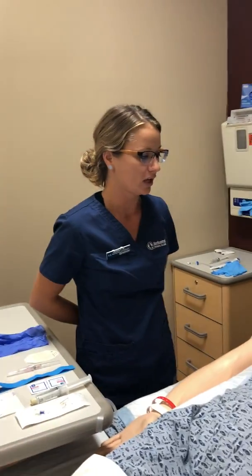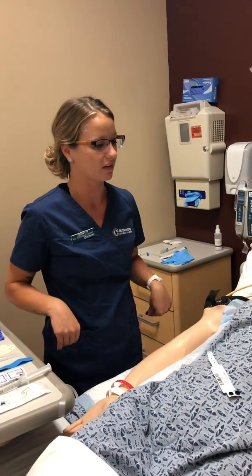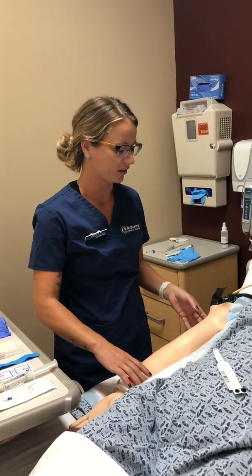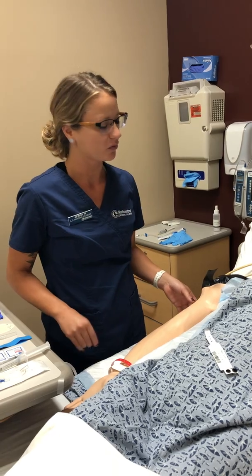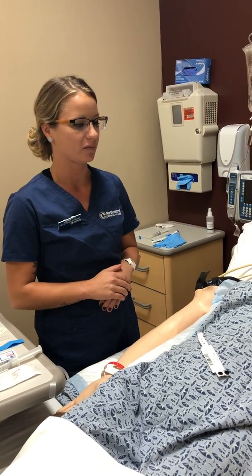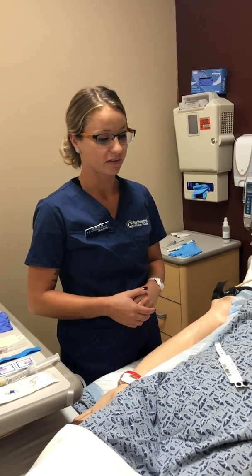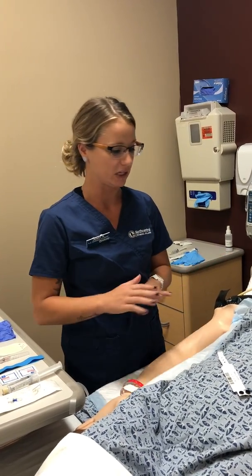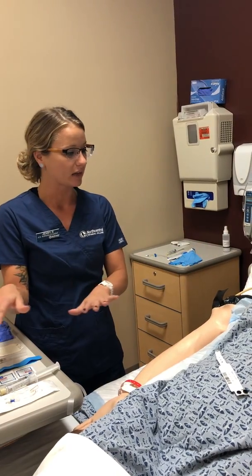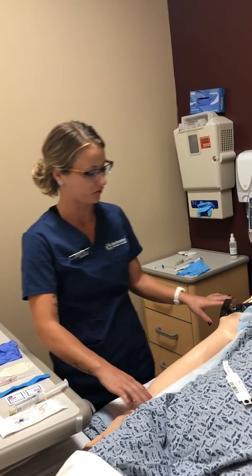I'd also want to ask her preferred arm, which is usually the non-dominant arm, which in her case it is, so she'll use her left arm. And so in that case, I also want to assess, make sure that she hasn't had a mastectomy done or any lymph nodes removed or any fistulas in place. If that were the case, we would not use that arm and use a different extremity. I see that she's in the lying position and that her extremity is dependent, which is the preferred position.